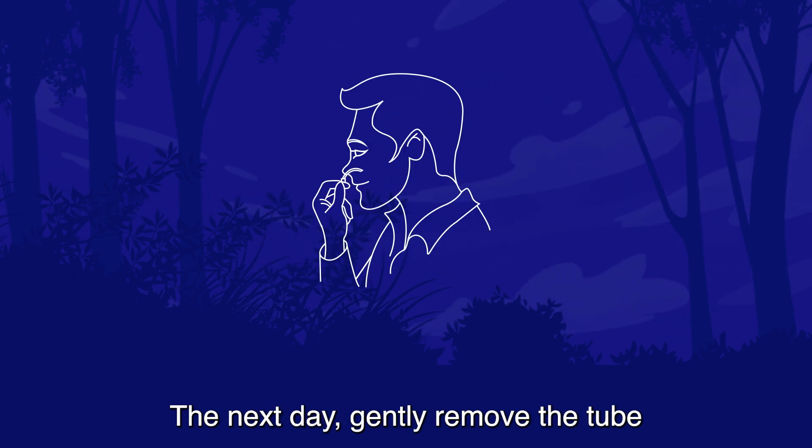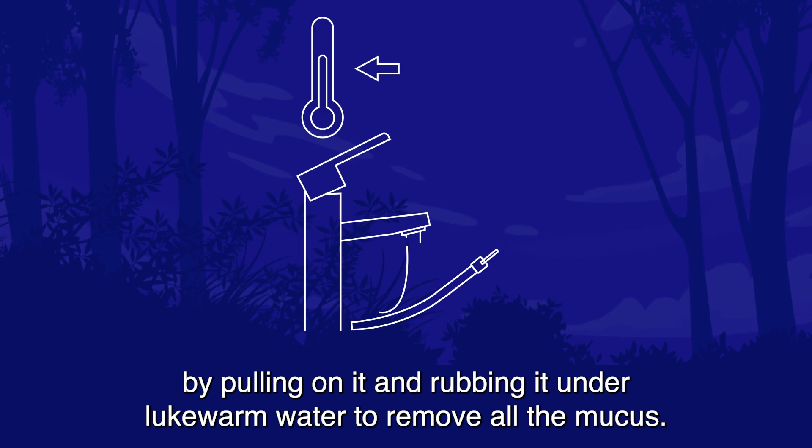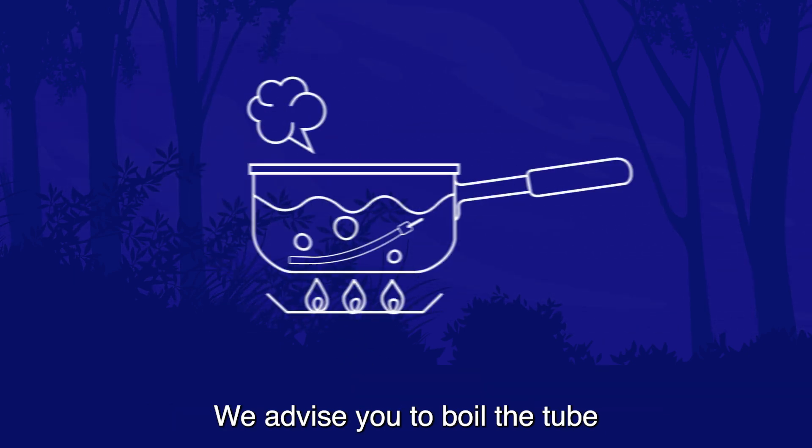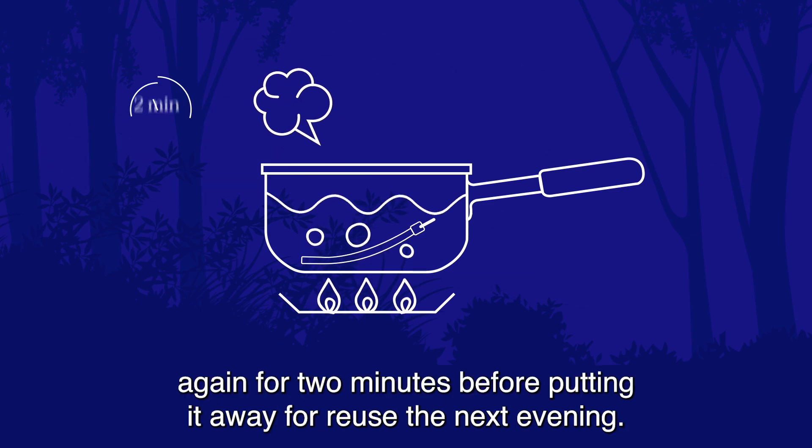The next day, gently remove the tube by pulling on it and rubbing it under lukewarm water to remove all the mucus. We advise you to boil the tube again for two minutes before putting it away for reuse the next evening.